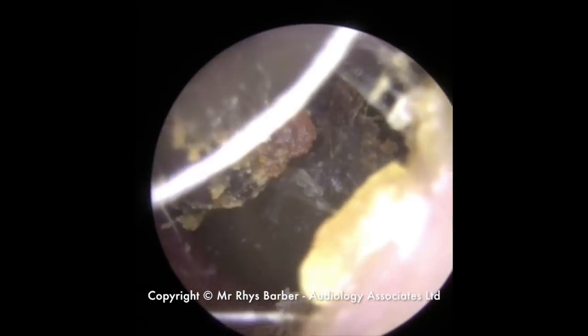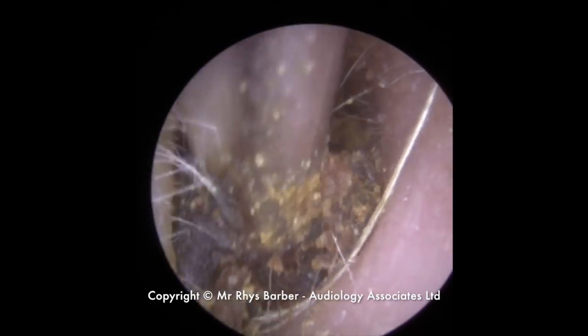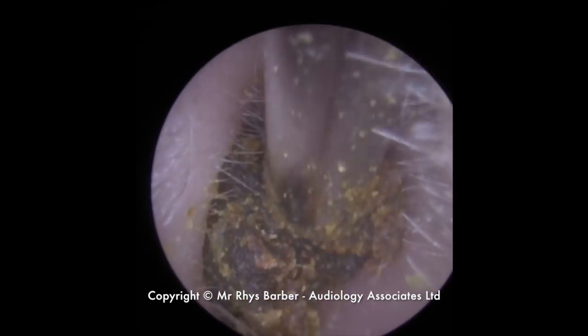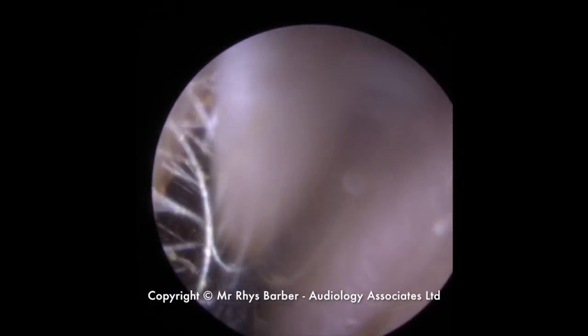Just trying to maneuver this out. There we go. It's working its way down the canal. You see how soft and sticky this is? See how it's breaking away and pulling apart? It's almost like a treacle or toffee consistency. It's pulling away, but we've got that section away now. There you go. There's a little bit more behind it.